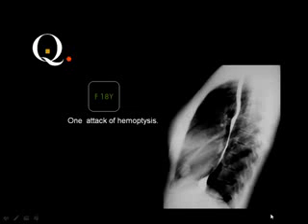By this we come to the end of the first talk, and actually at the end of any talk I present to you some quiz cases in order to see how much of the knowledge you have acquired. Before interpreting the chest X-ray, you should first know what category you are dealing with. Are you dealing with a nodule or a mass or a patch or a cavity? Then you will start the differential diagnosis.